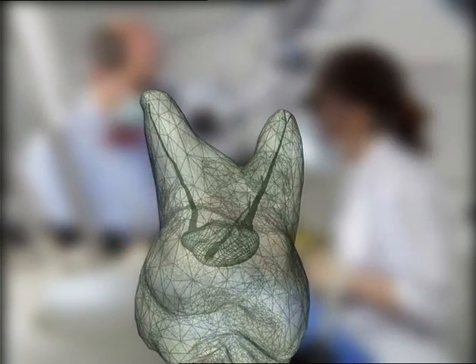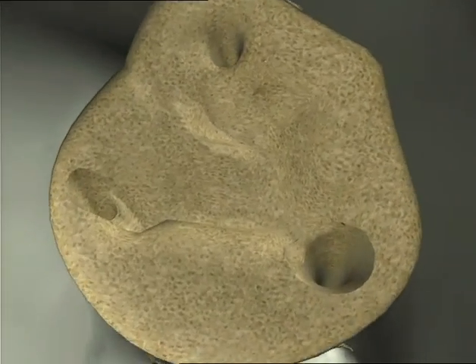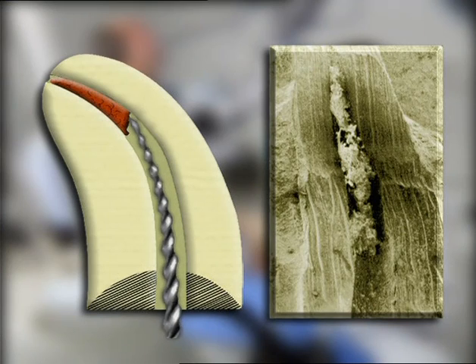The root canal preparation should occupy as many planes as are presented by the root canal system, that is, multiple planes. This objective preserves the natural curve or flow. The apical foramen should remain in its original spatial relationship, both to the bone and to the root surface, without any type of transportation.